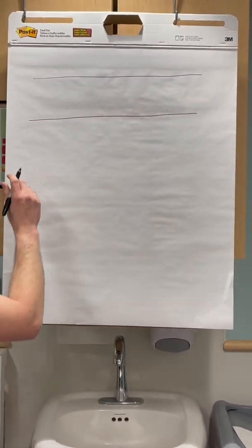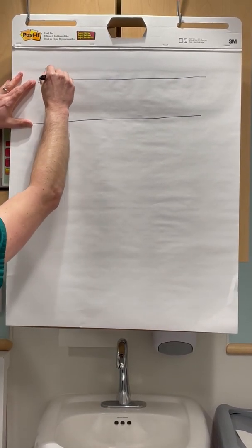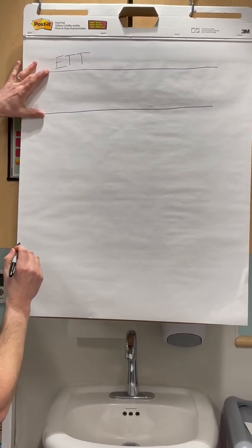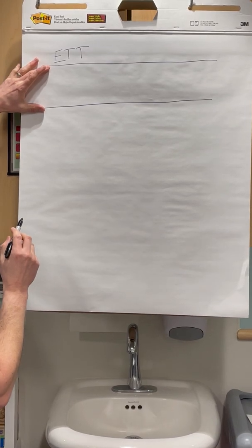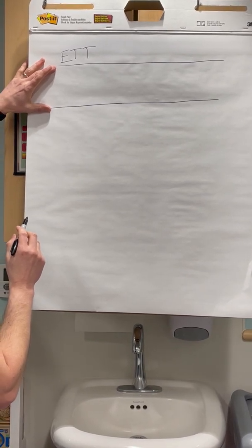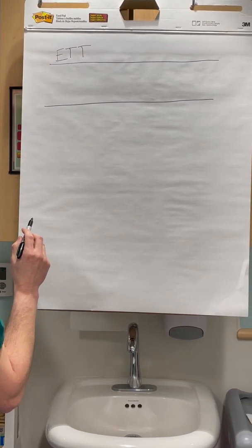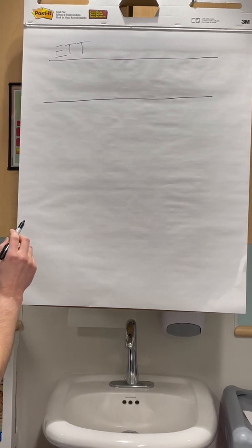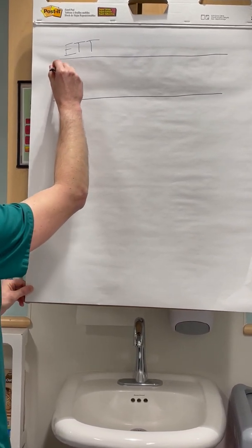So we're going to say these two lines would be your ET tube, all right? These are the walls of your ET tube. And how the oscillator actually works is small waveforms pushing in oxygen and taking away carbon dioxide. So you're going to have a waveform.